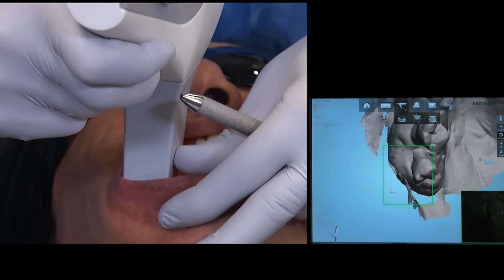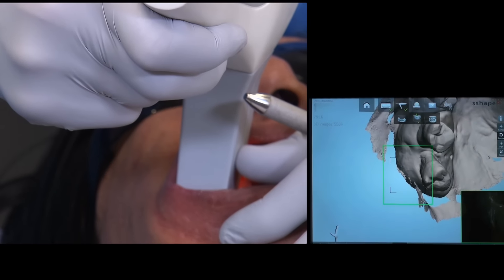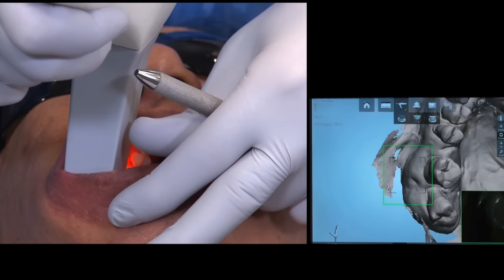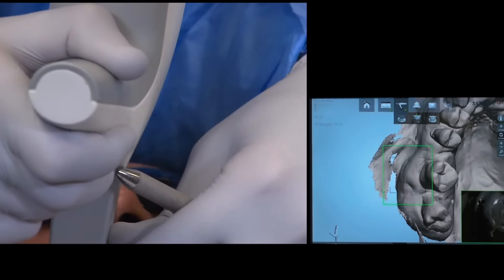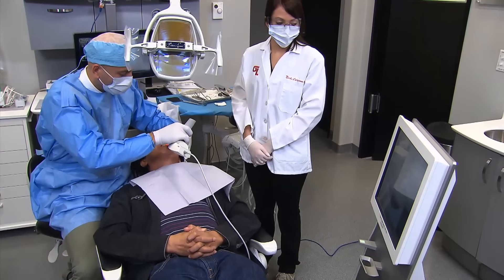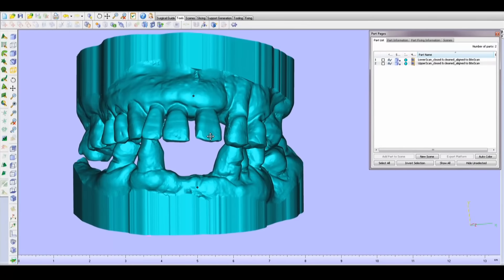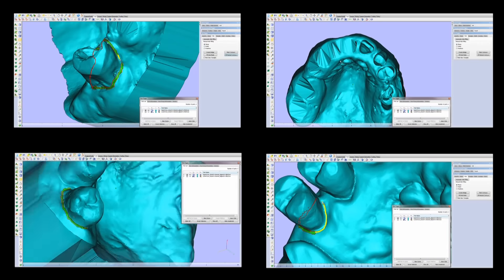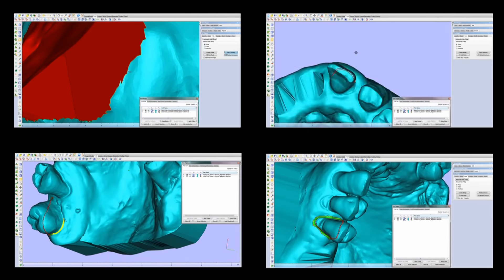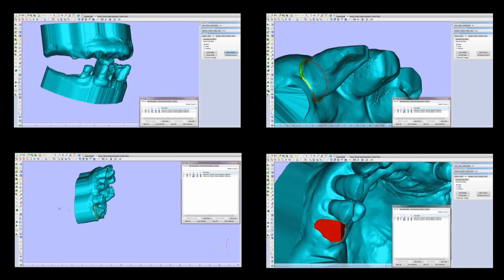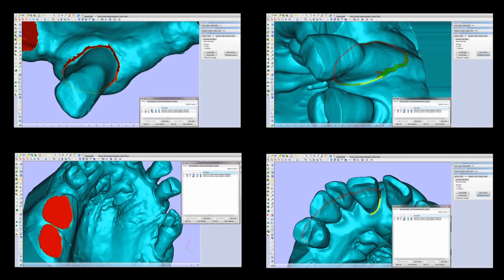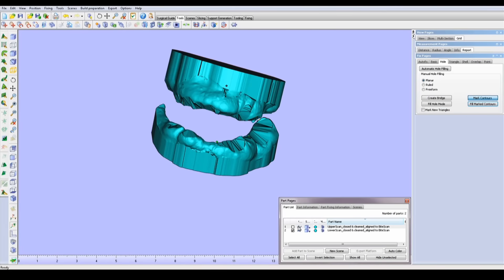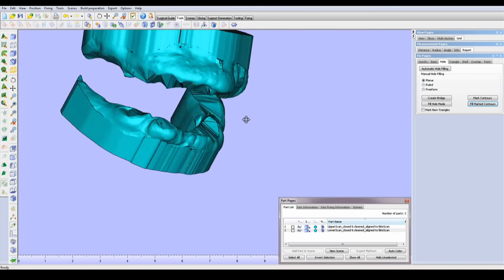So I went ahead and utilized a Trios 3Shape intraoral scanner. As you can see on the screen, the impression making is made fairly easy using the scanner. The next step is to upload all that information captured from inside the patient's mouth onto software where the denture is designed. Before the denture is actually designed, we digitally extracted the teeth — treating this case the same way as we would on a stone model in the laboratory. In this case, we extract all the teeth in both arches, and as you can see, we now have an articulated model with the teeth missing.